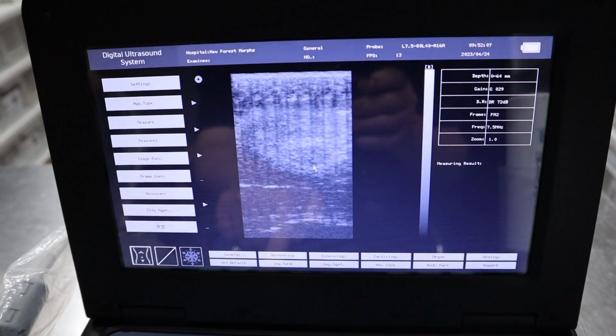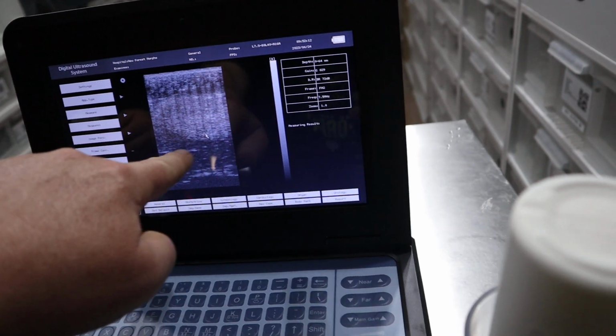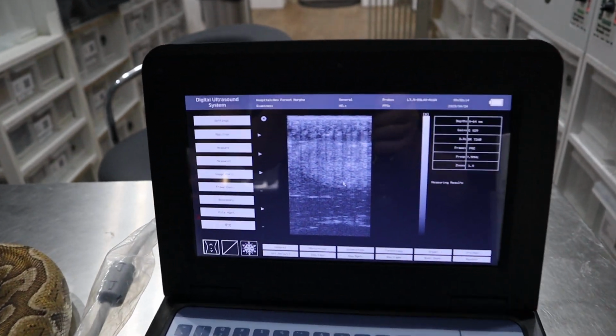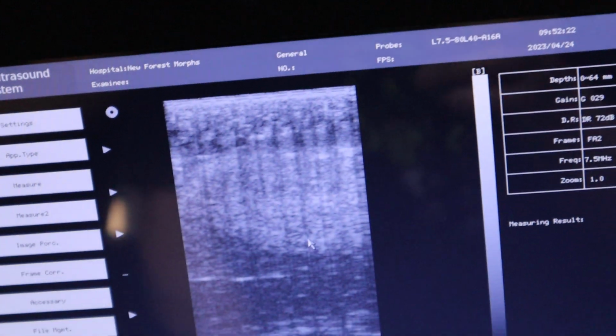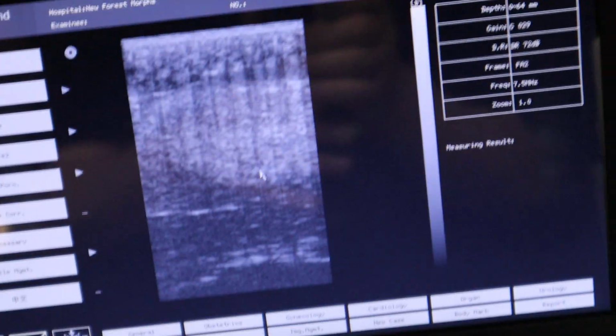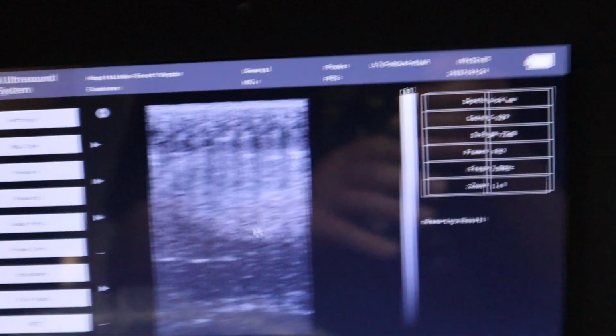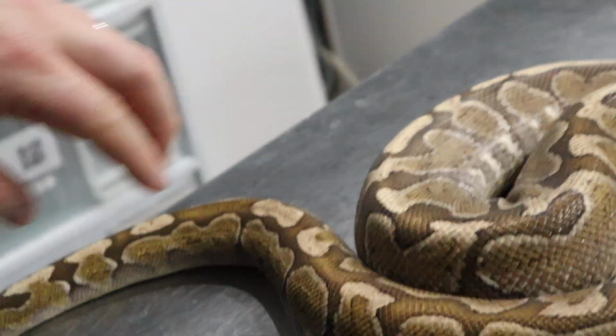Is it set to the bottom there? Top one, please. So I can see like an egg shape there. Yeah, I see that. You see it? Let's have a little look. So they look big. Probably, well, we can measure them, but I'd say that they've got to be close to 30 plus, haven't they? I'll have a go at measuring them, Jared, if you want to put her back, clean up and put her back. Well, she's being well behaved anyway, so we'll just measure her up and see how she's doing.